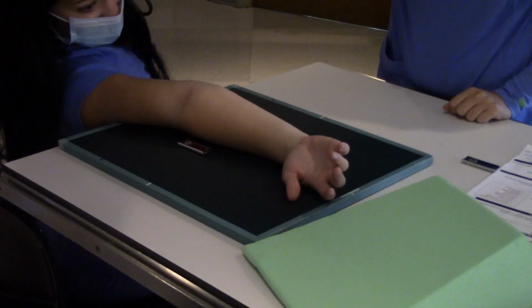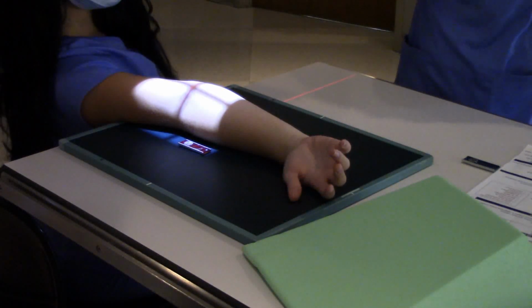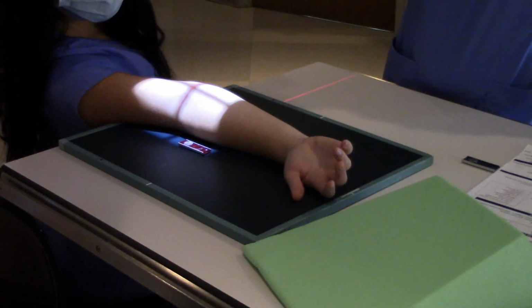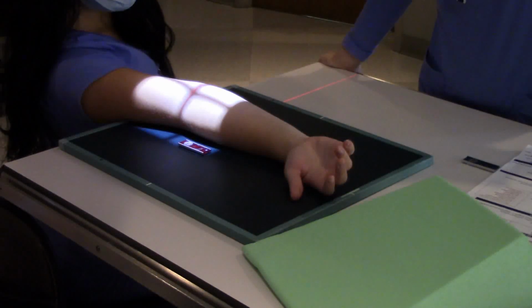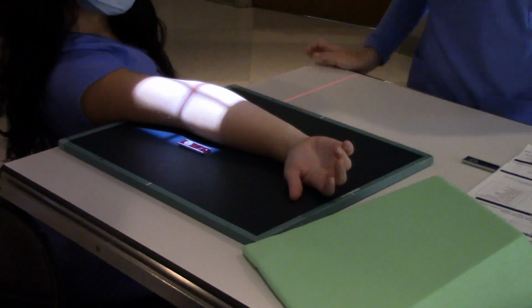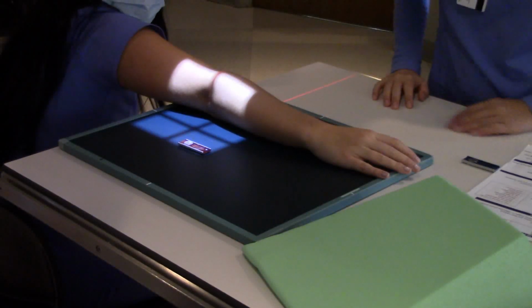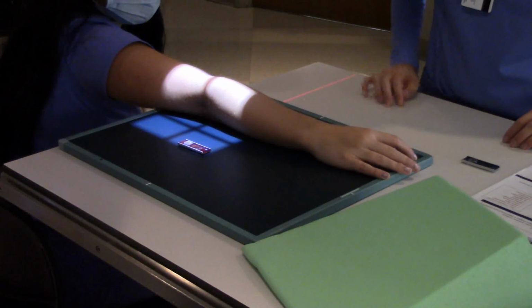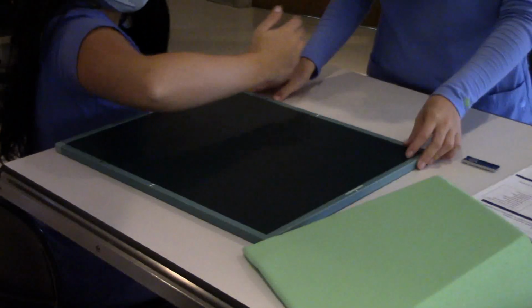Now on the external oblique, we're looking for something in particular. We want to see, I know it was right there on the tip of my tongue. It's got something to do with the radial head. Oh, that's right. We want to see the radial head free of superimposition, and hopefully with an open joint space between the radial head and the capitulum. Okay. Very good. So that's how that goes. And then the lateral. Now lateral elbow.